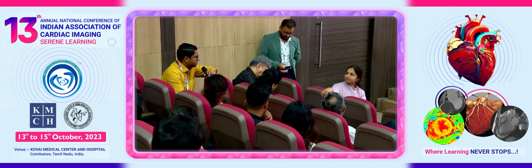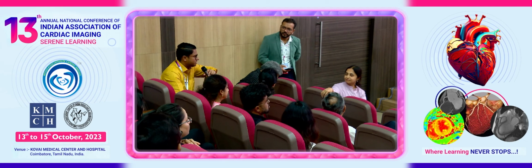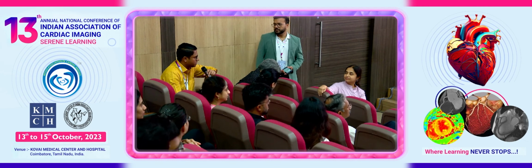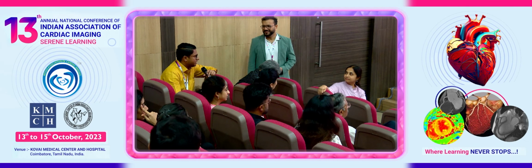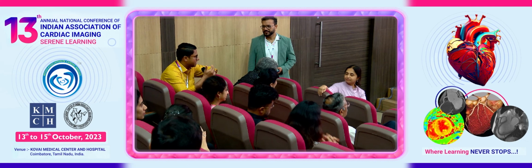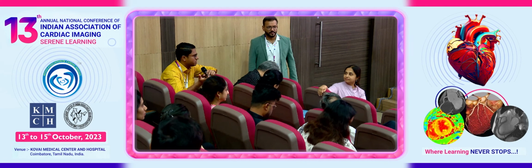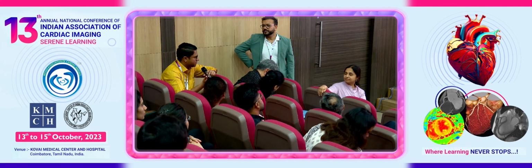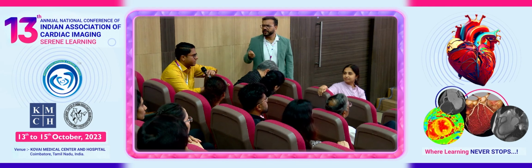It's not like I just scan the patient, give off the CD, and then close that. No, it doesn't happen like that. I give all the measurements with my report. And if there is a discrepancy, I get a call back asking, is it really so? Sometimes, for example, as ma'am said, the coronary heights, a different measurement comes out of the company, and I get a call. I just say, no, that's not the case. This is the right measurement.